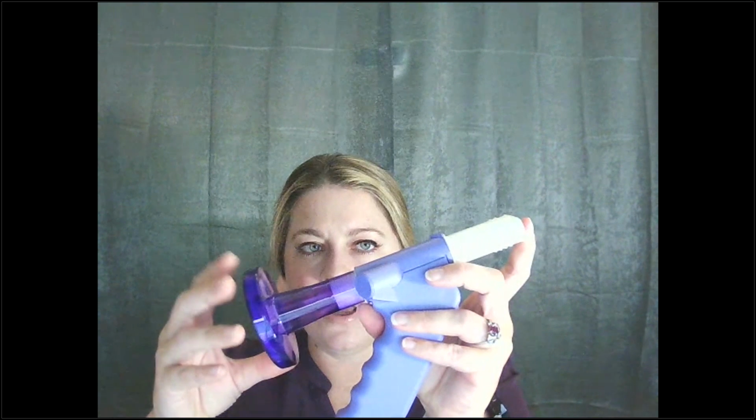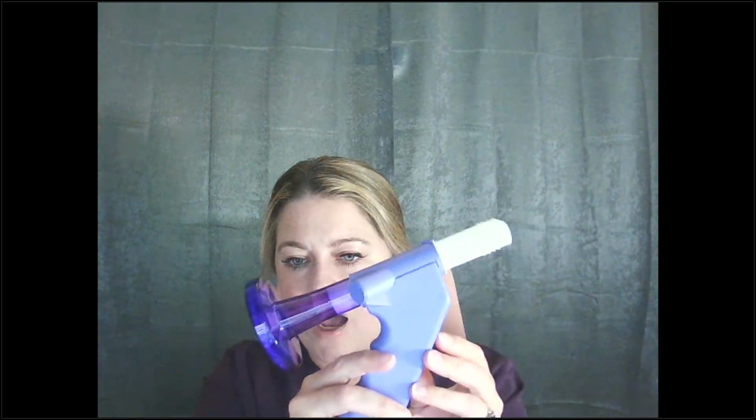Just be careful when you are putting the filter on that you don't pop the mouthpiece back out of place, because again, you'll get that Spirette insertion error, and it will ask you to check your setup. So make sure that the filter is on nice and snug, but that you did not pop out your mouthpiece from its arrow-to-arrow position. All right, today, since I'm here, I'll go ahead and test with the filter for you guys. And then you'll also have, of course, your nose clips.